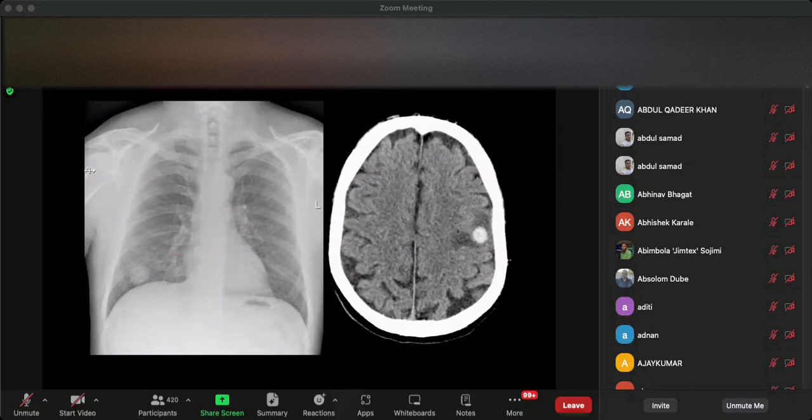Okay, what have we got here? I did a lung biopsy on this particular nodule, and when I removed the pathological specimen from the actual biopsy gun, it was jet black.